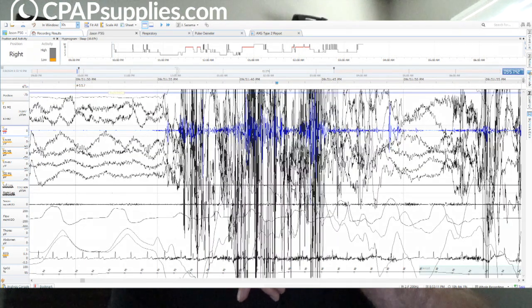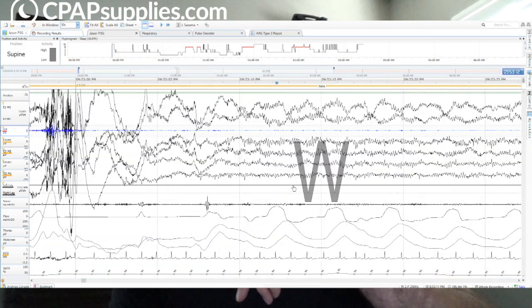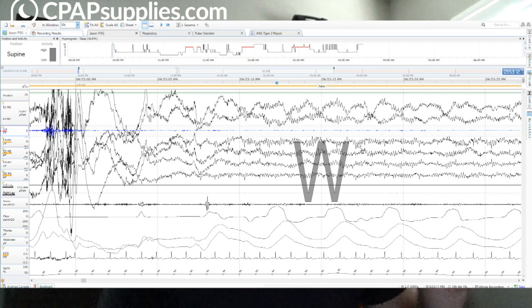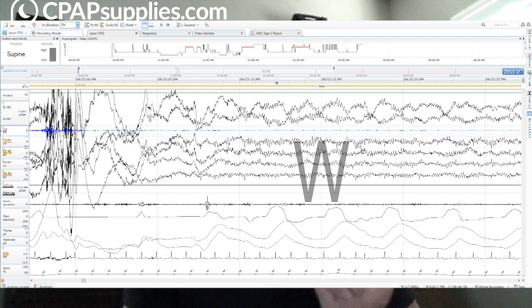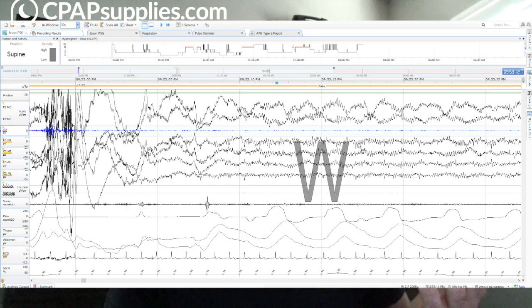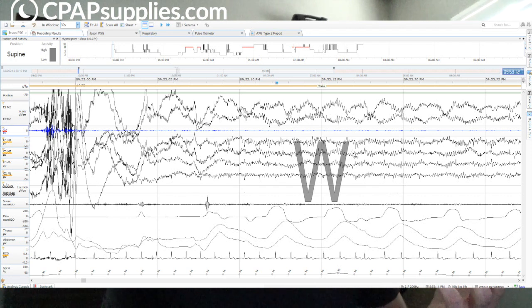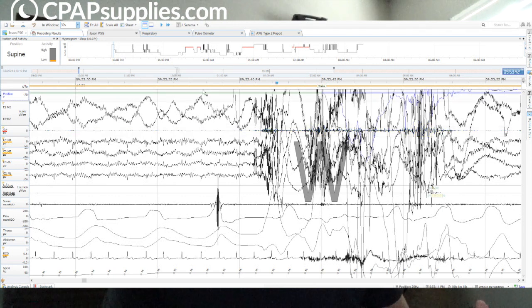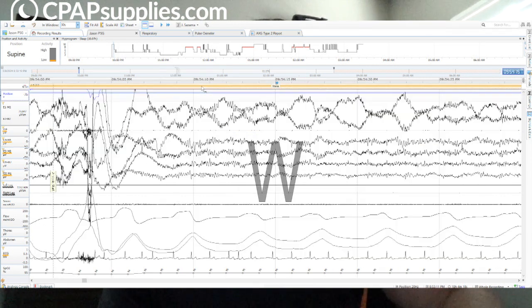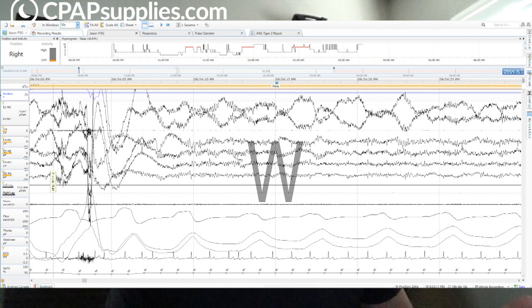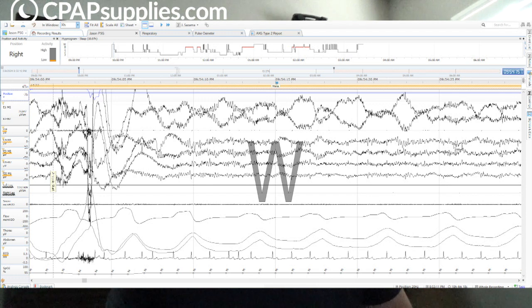Okay, so they're awake right here. All this stuff is awake. This is alpha waves, eight to 12 cycles per second or eight to 13 cycles per second. Basically, it means eyes are closed but they're still awake. Let me get this actually centered on the right there. Still awake, but it's starting to look a little drifty over here. This has been a shift in EEG.